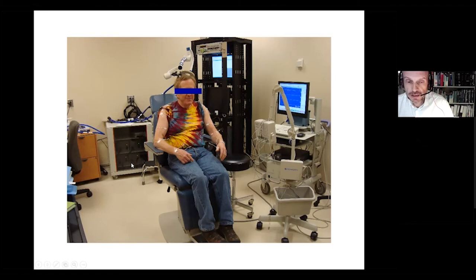What you see here in the background are 4 capacitors. So the main limitation, technologically speaking, is the limitation of capacitors to maintain a high impulse in order to do high frequency stimulation. And that is currently still the limit.